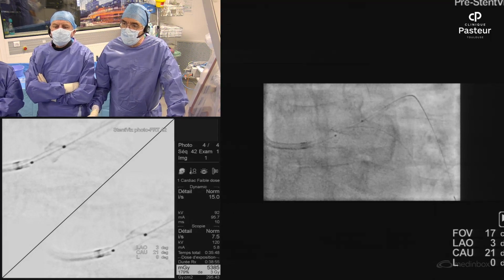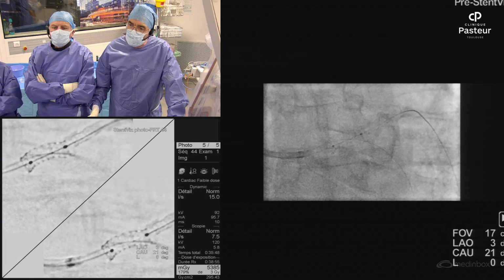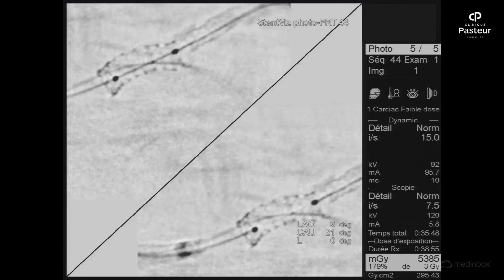So you will see after the stenting, it is very important to achieve this. Yeah, so better now, very nice results. So you see, Jean, clearly that you have already a nice opening of the strut toward the circ, with a good scaffolding. So it looks very nice.